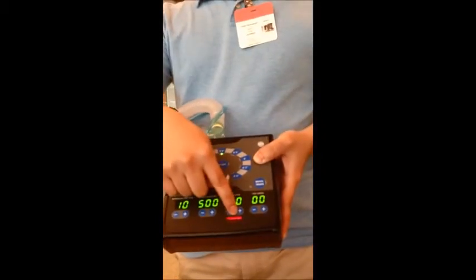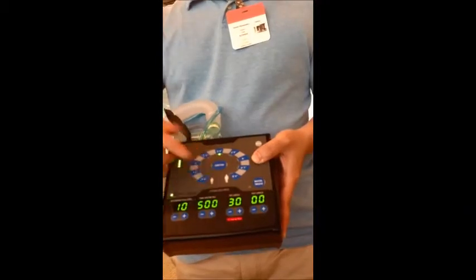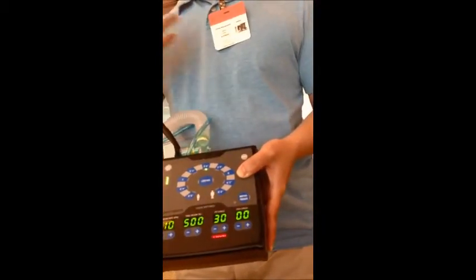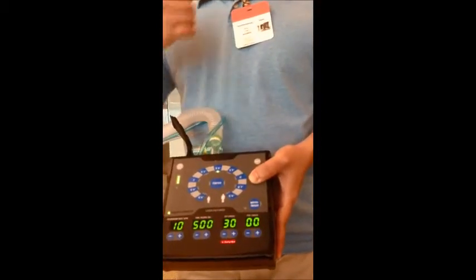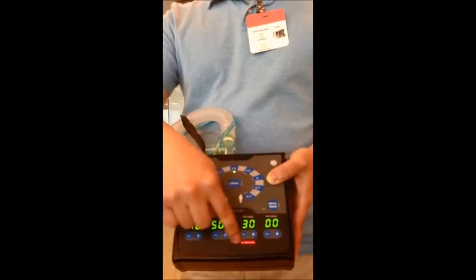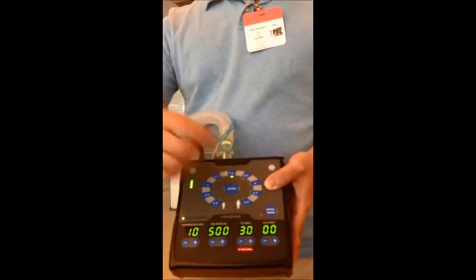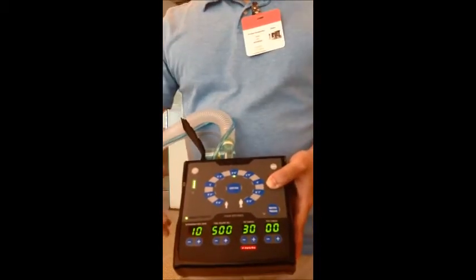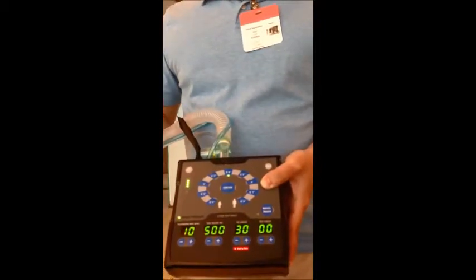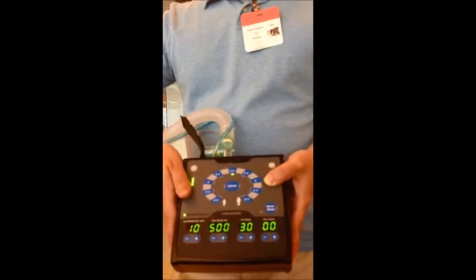That alarm that was previously blinking has gone solid. This happens if someone is not looking at the ventilator when the alarm happens. If a patient coughs, air pressure is reached, it'll hit that alarm, but once it's cleared, it'll turn solid, and after 30 seconds, that alarm will disappear. That way the user doesn't have to be bothered with it, it'll clear itself. And so right now, it'll deliver as necessary.